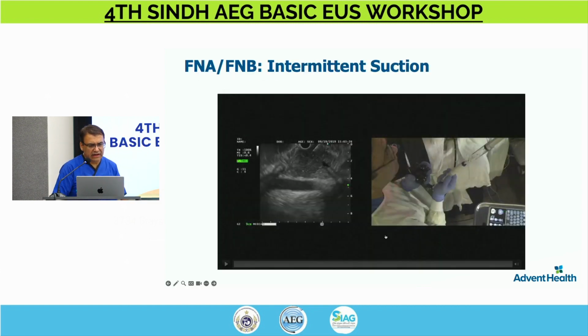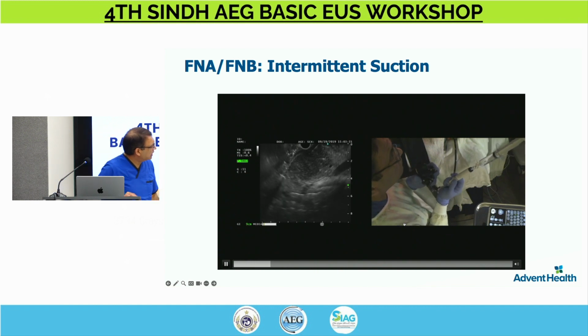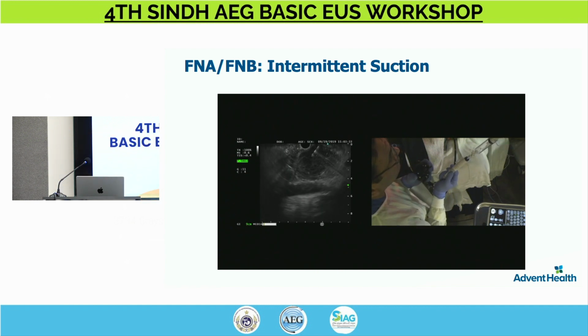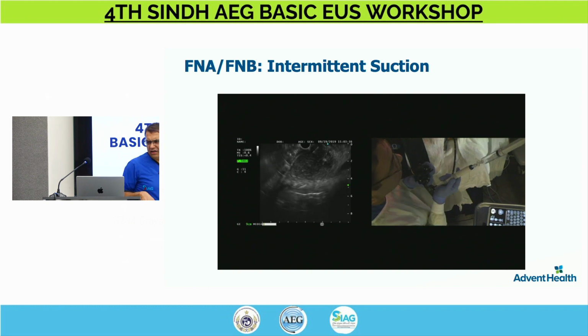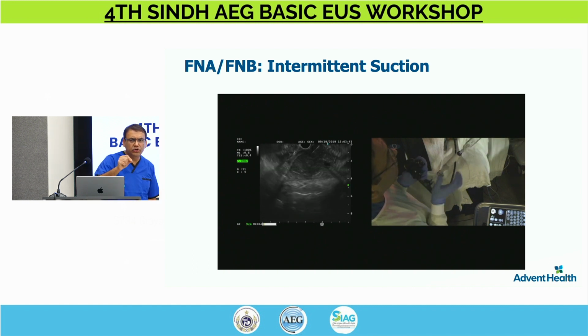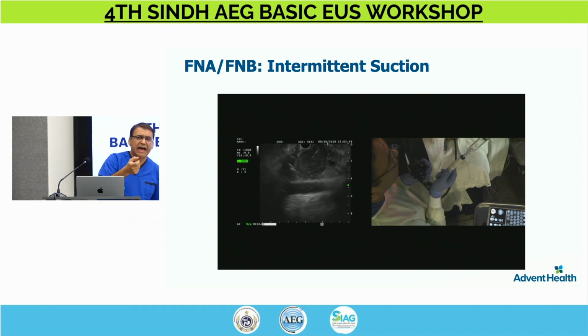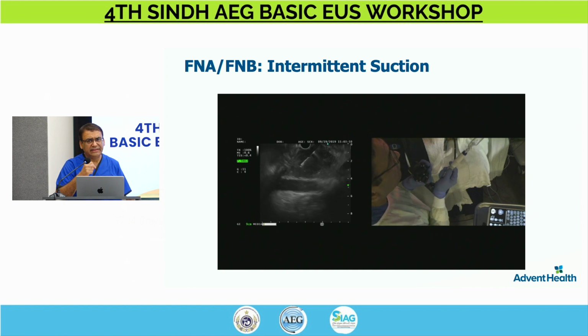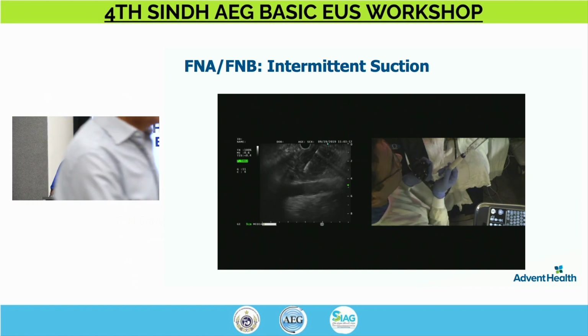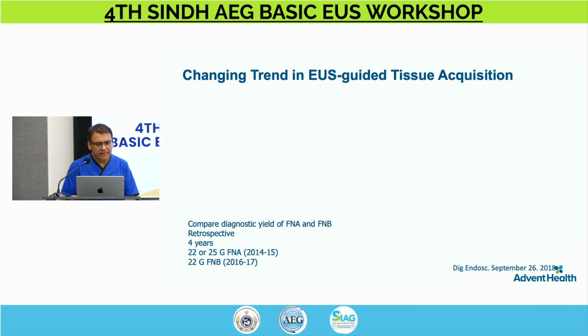Okay? And I think this is the Olympus needle I was using. I had to make a video for them, so I'm just showing how I use that intermittent suction. You can see the suction on there. First one, I go in, a few back and forth, no suction. Then I'll open up the suction, back and forth a few times. And then after that, close the suction again. And the last part, I want to do it without suction.